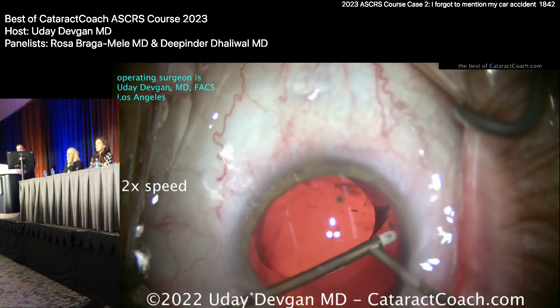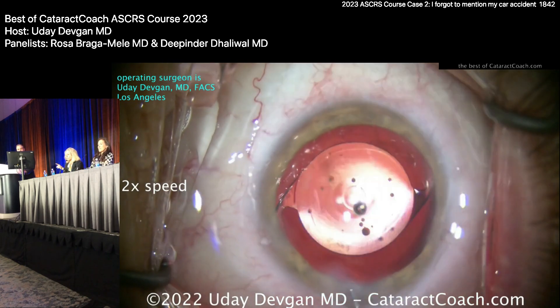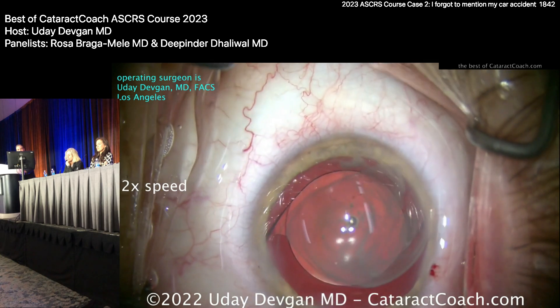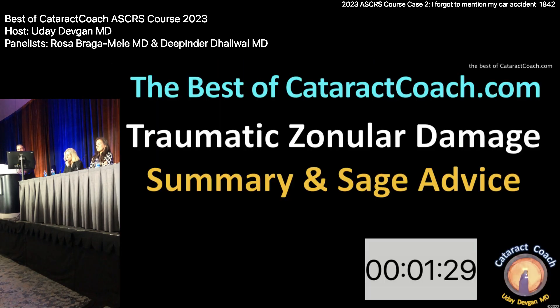Patient's going to be pretty happy — the eye was about 20/20 minus. The bad thing about the zonules is they let little pieces go by, and then patients forget the 20/20 vision and say 'doc, I have a floater.' Triamcinolone — luckily nothing did prolapse. Weck-Cel sponge check. Case summary: what would you have done differently? Visco dissection for the cortex absolutely, and once you have the CTR in after visco dissecting the cortex, you can squeegee it up off the posterior capsule — when you put the IOL in, it comes out so fast.